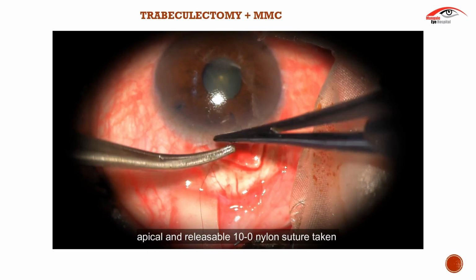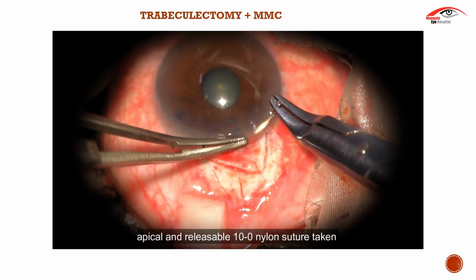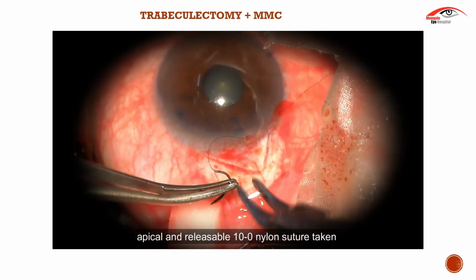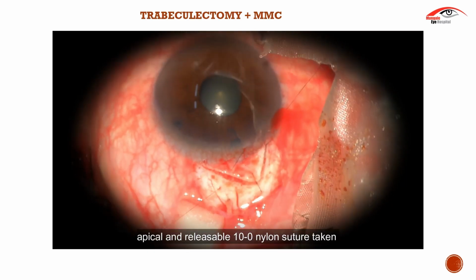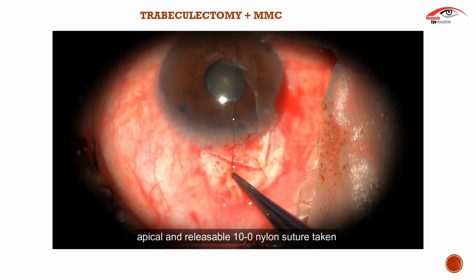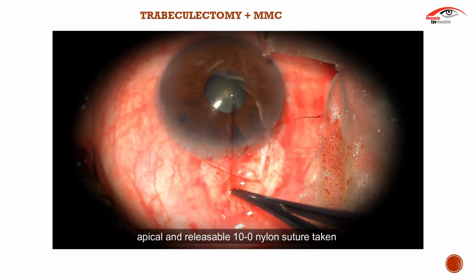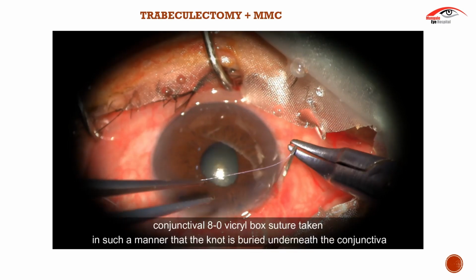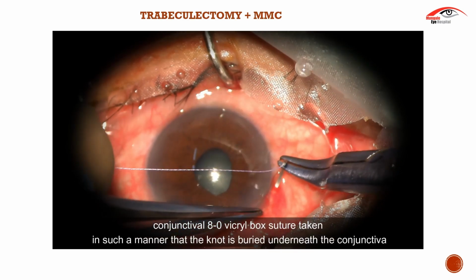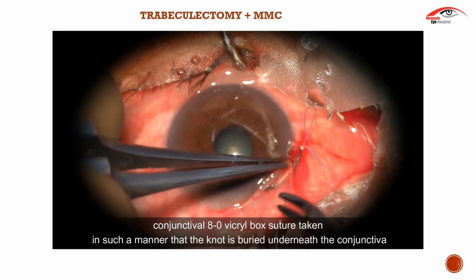Apical 10-0 releasable suture is taken. The conjunctiva is sutured with 8-0 Vicryl suture.